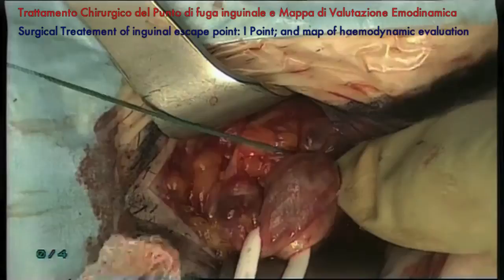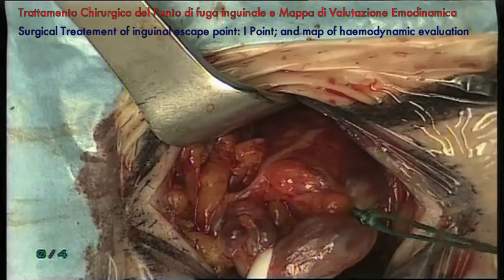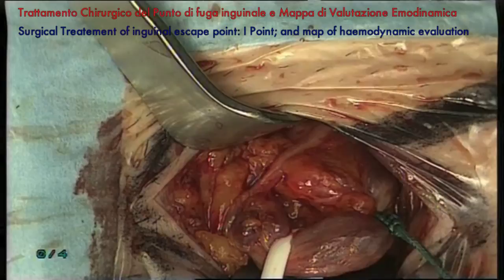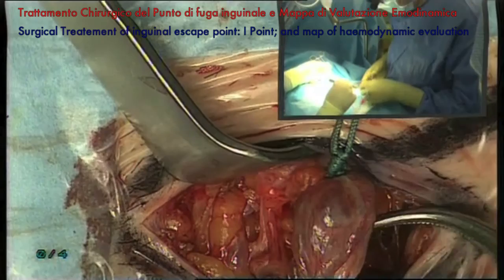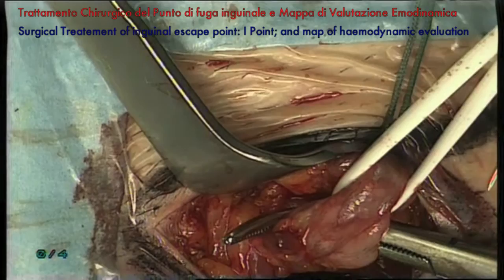This is a non-absorbable thread. This is just the first ligation out of four. Hold it, Paolo, give a clamp. Adolfo, cut please. Hold here, pass the ligatures. Paolo, hold this for me please.